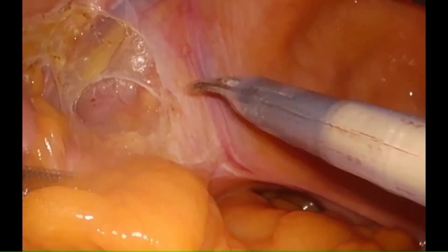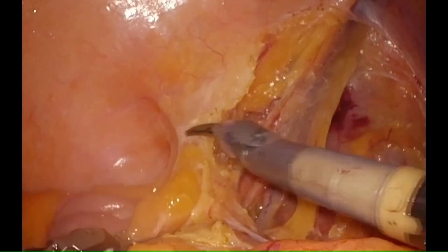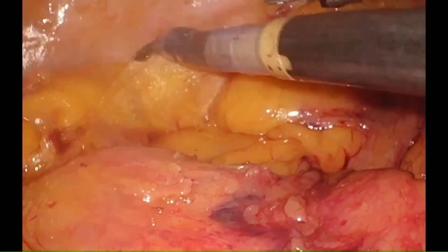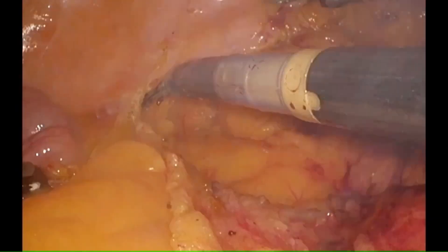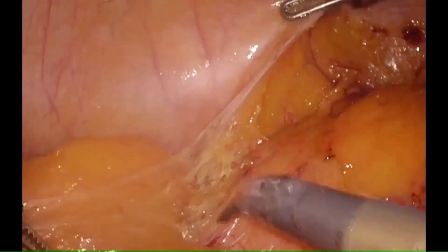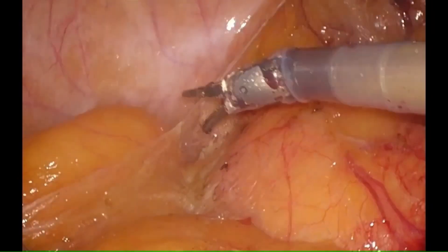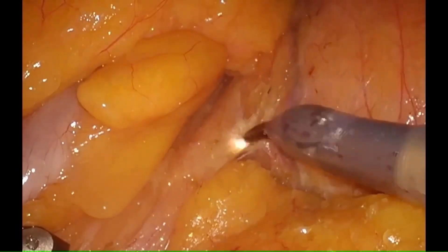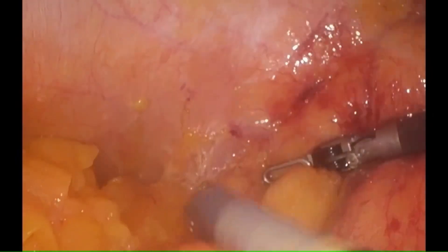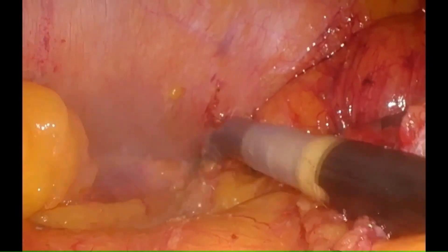After completion of medial to lateral dissection, we start the lateral line of Toldt division for colonic mobilization. The port placement and cart position allows us to easily perform a multi-quadrant surgery with appropriate exposure and arm movements without any internal or external clashing. Here we show how we easily achieve complete colonic mobilization with sharp dissection using monopolar curved scissor.